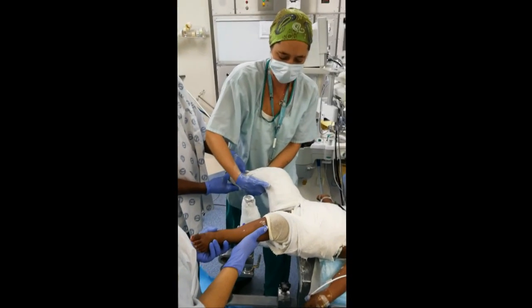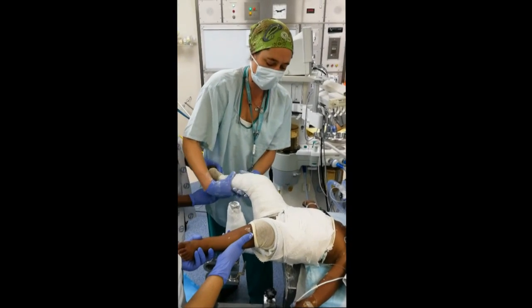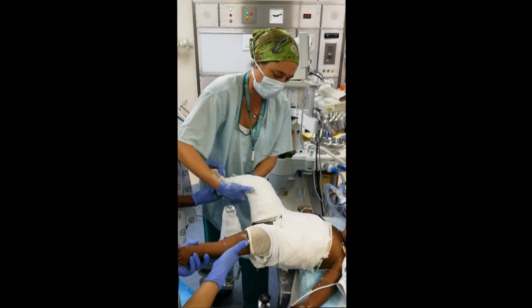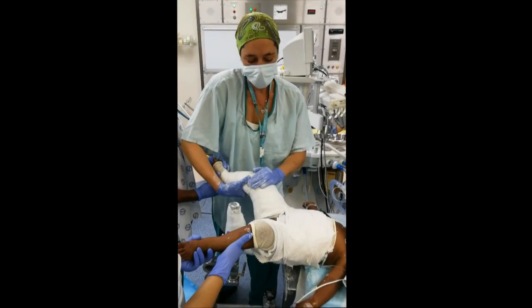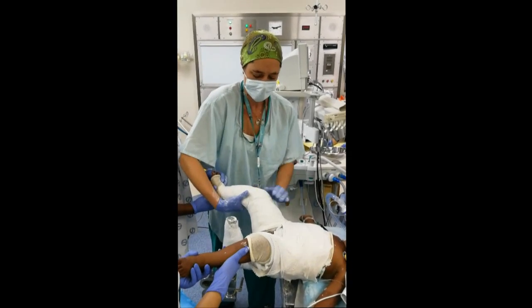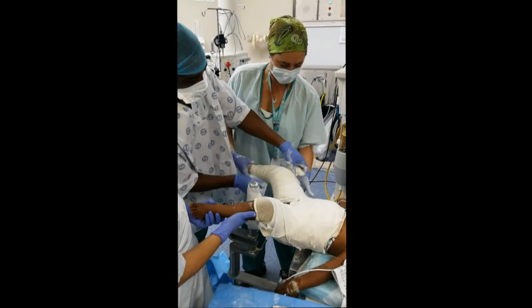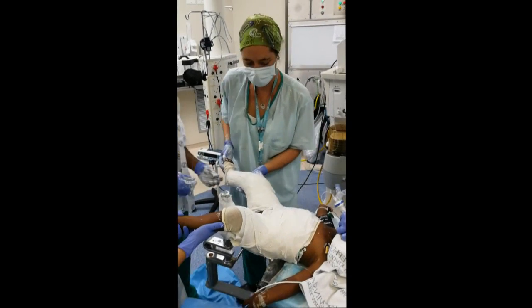You have a slight pressure on the back of the femur. Now that the cast is complete, you're molding the femur from the back. Take your alignment and make sure you don't have internal or external rotation. Maintain 90-degree flexion, and without putting pressure on the back of the knee, apply axial traction on the femur with a little apex anterior mold. Maintain this until the cast has set. This is essentially the total of your effort to reduce the fracture. At this age, children remodel basically in the plane of the knee. That's the most important part of the spica application — the rest is cosmetic and reinforcement.